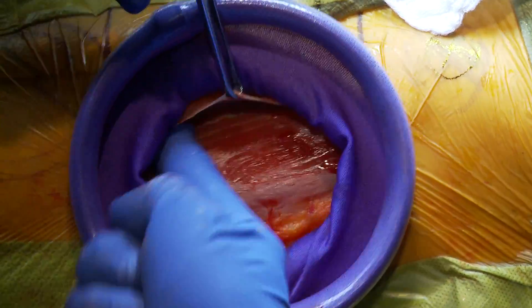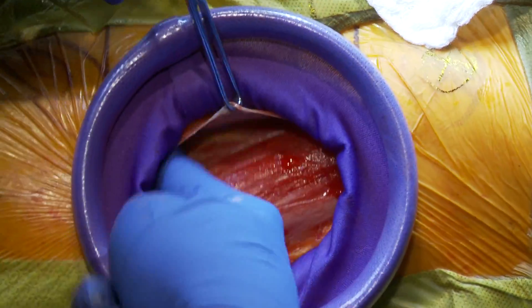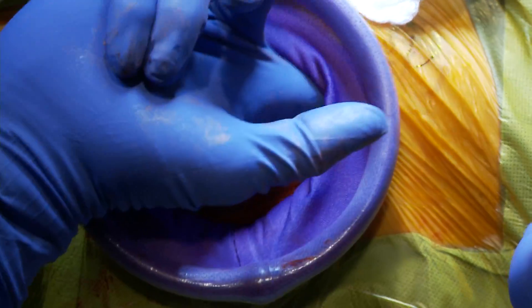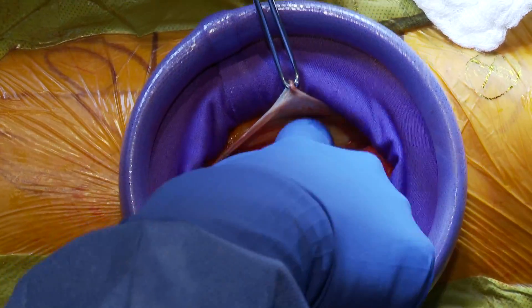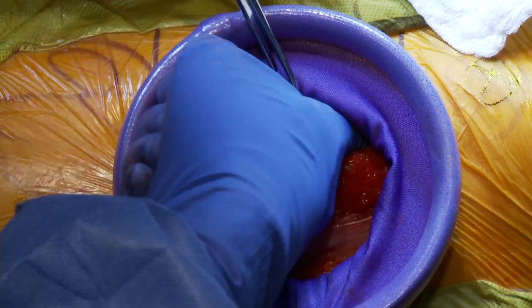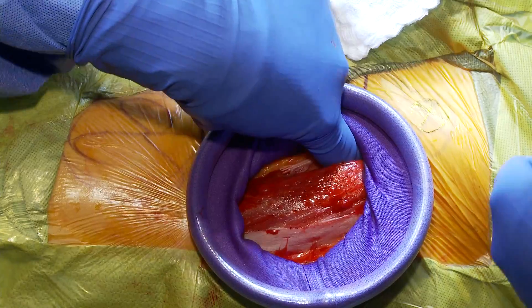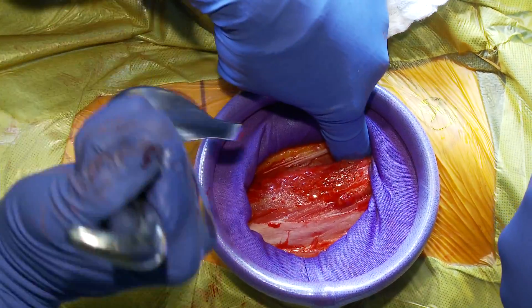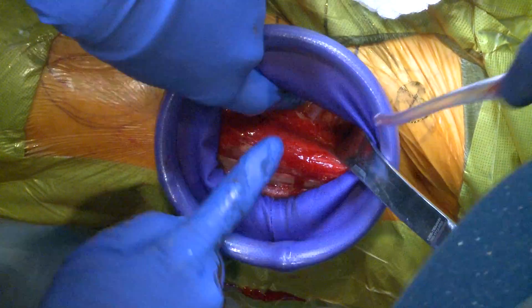This is a little bit of a modification from the traditional Smith-Peterson, which would go between the sartorius and the tensor fasciae latae. This approach goes through the tensor fasciae latae. I've basically dissected the TFL free from its fascial plane. Now I'm using my finger to get over the superior femoral neck, and I'll take a curved cobra retractor that will go over the superior femoral neck.